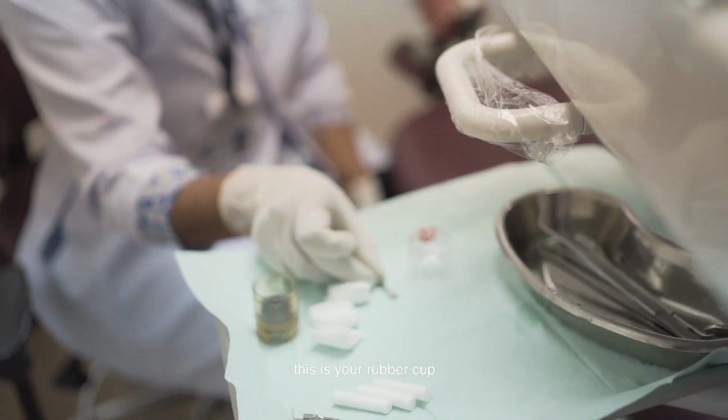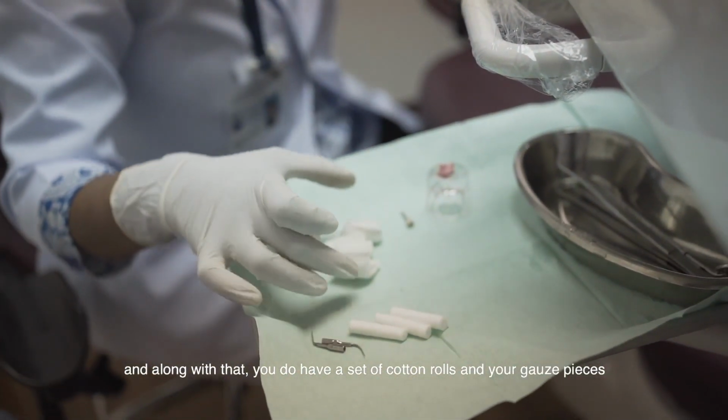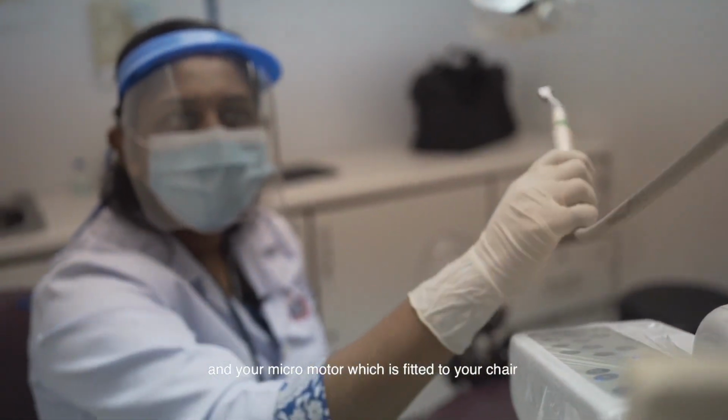And you have your rubber cup, and along with that you have a set of cotton rolls and your gauze pieces, and your micromotor which is fitted to your chair.